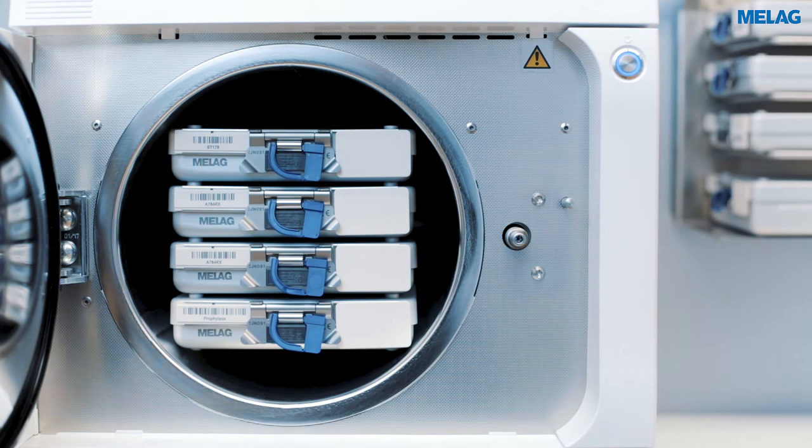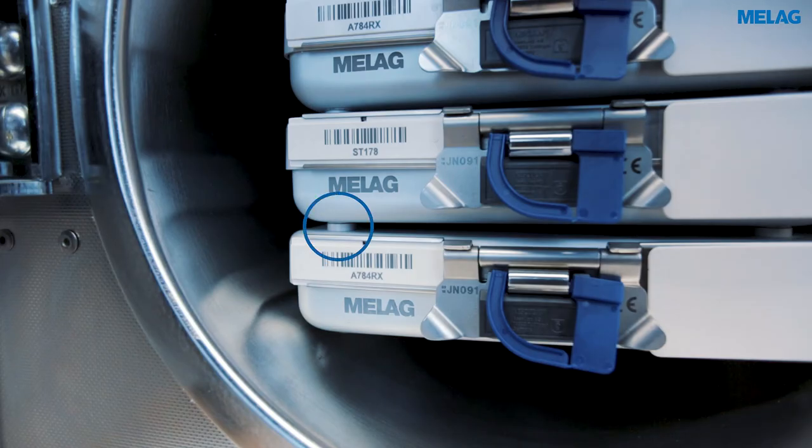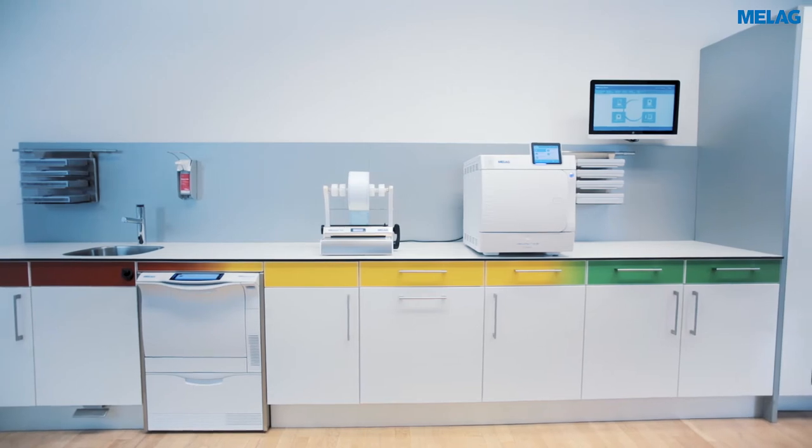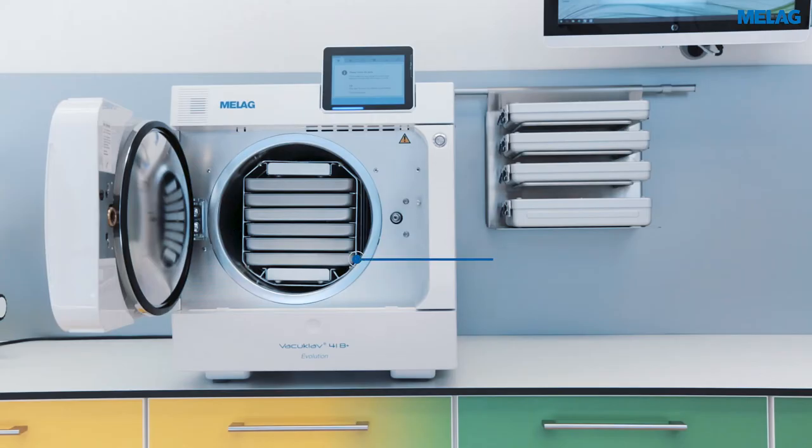Without a mount, the stacking feet guarantee successful steam penetration. The E plus mount for up to eight trays allows the sterilization of a large number of wrapped and unwrapped individual instruments.